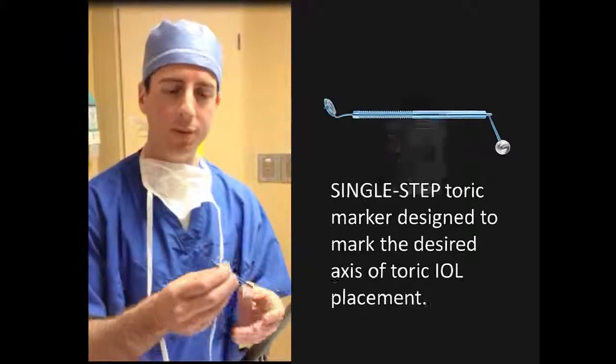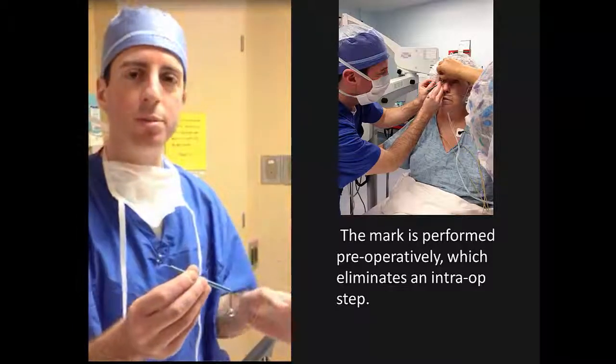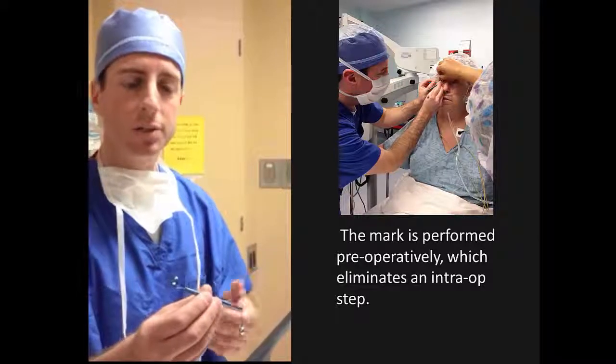Richmond Toric Marker. What we've done with this design is try to make a single-step toric marker to avoid having to mark once pre-op and then again in the operating room, to try to get it more accurate and with less chance of error.